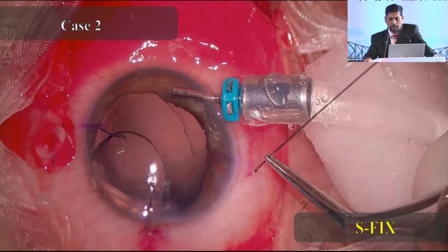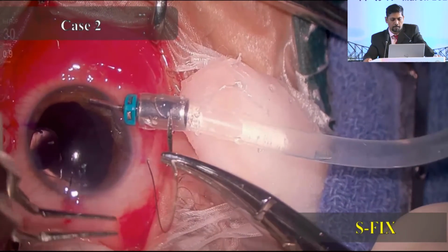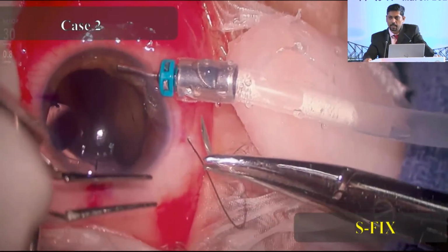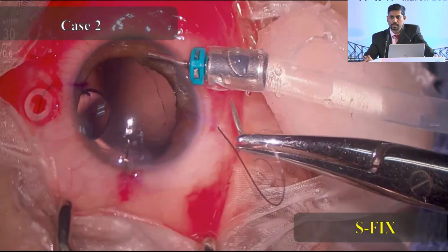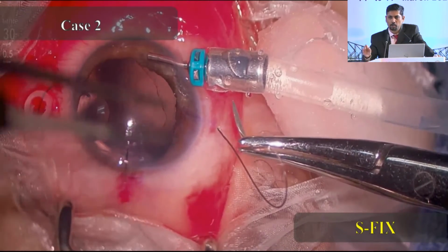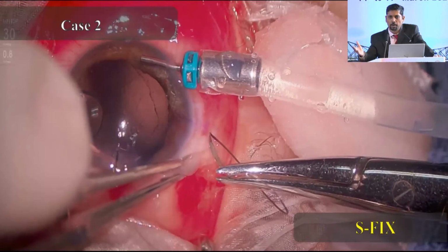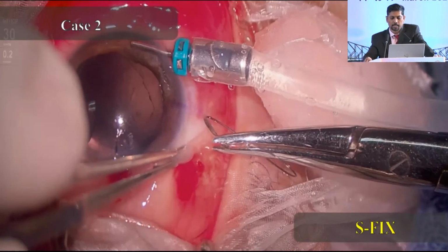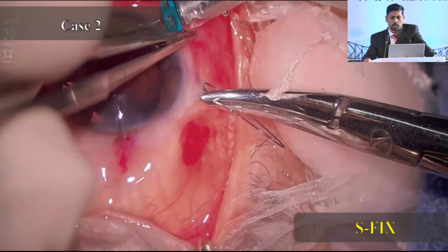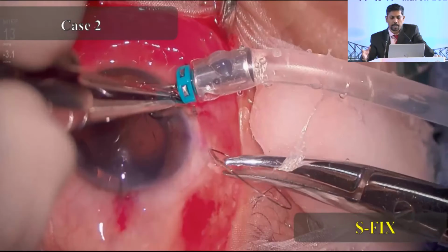Dock it, push it, and take a suture bite starting from the point of sclerotomy. And again, reiterating that in scleral fixated surgeries, if you want good IOL centration, there are 2 things that are important. One is the sclerotomy points that you make, which should be 180 degrees apart and equidistant from the limbus, either 1.5 or 2 mm, but it should be symmetrical on either side. And then how symmetrical the haptics are placed. So these are the 2 points that are extremely important to get good IOL centration, whatever be the technique.